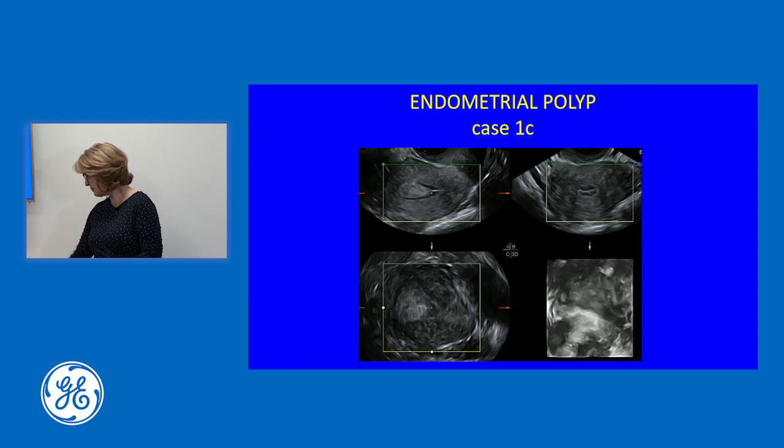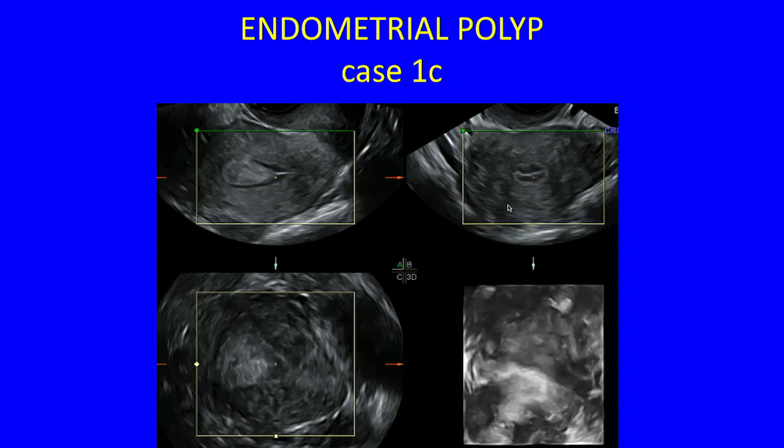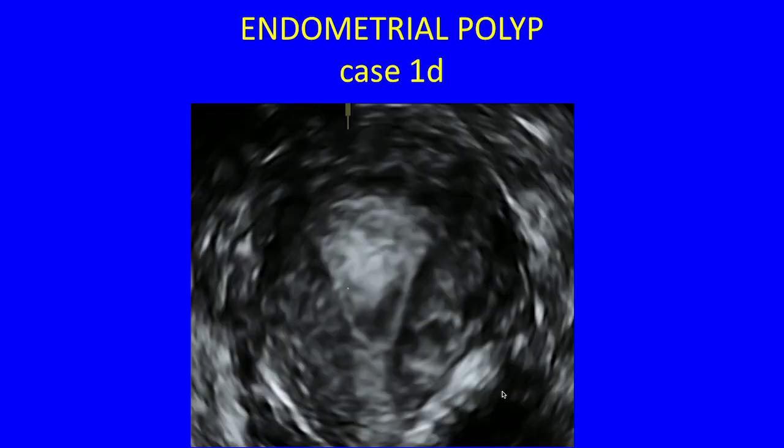And when I put the 3D on that, again, you select a box, you take your view, longitudinal, transverse, coronal, and then rendered. You need to squidge in your box, as you'll see, putting the green line in the center of your region of interest, and then when you do that, you come up with the rendered view, and here you can see the outer contour.